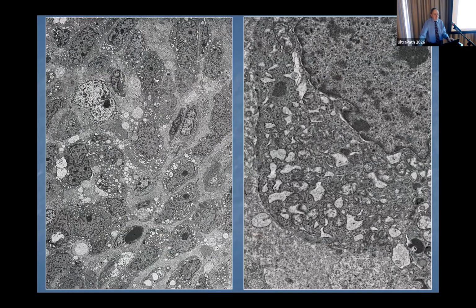So if you look at this with electron microscopy, at this point you're trying to prove that it is an undifferentiated sarcoma versus something else. I think EM is very helpful in that way, because if you can prove that it's some other type of tumor, you've got something to treat, versus saying it's undifferentiated. Basically, resection is the main treatment for this particular patient.